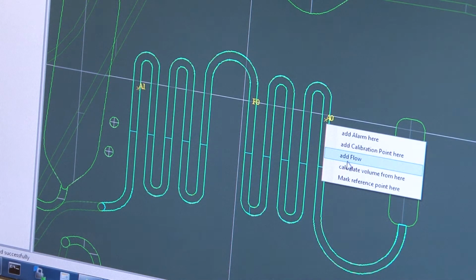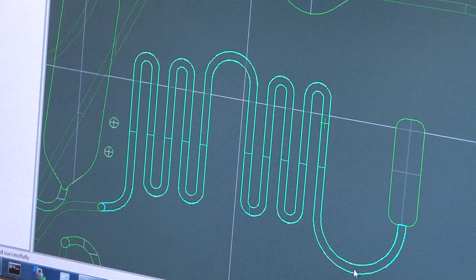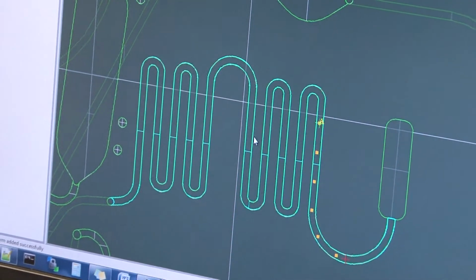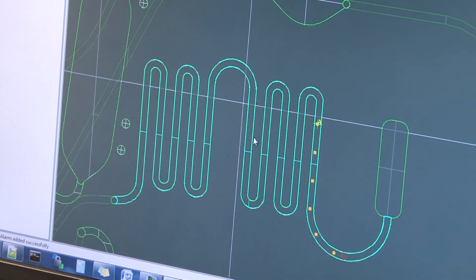And the software is also capable of performing volume measurements from point to point in the flow, like this. So that's about the basic functionality of the software. It can also save and load from XML files so that every annotation made is not lost. And we can also add annotations to ones already made by another user or another instance of the software, for example.